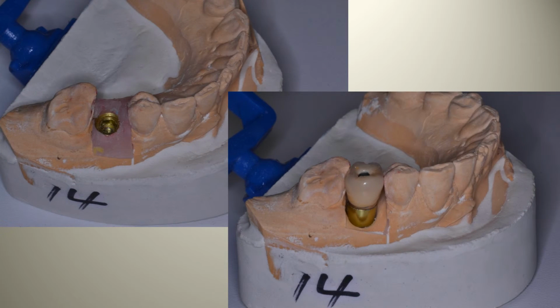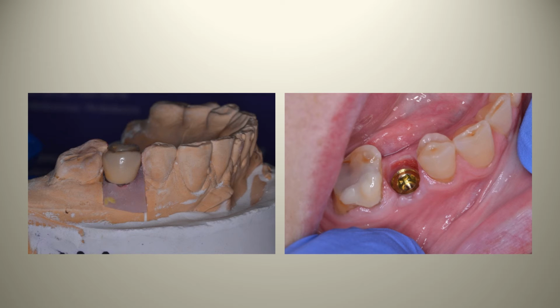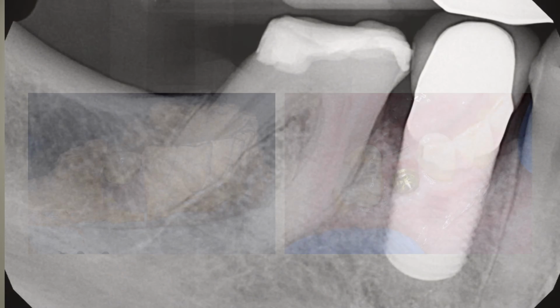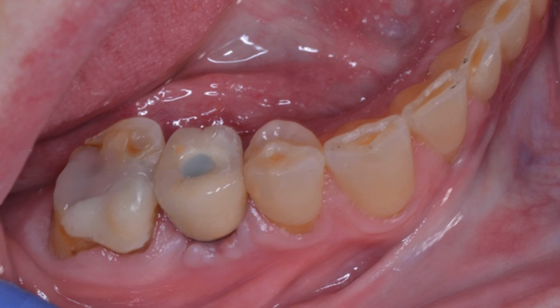And in the next picture, you can see, in this case, we're just sending a UCLA abutment. So this is just one of those cast abutments that are going to be used for this particular 5.7 millimeter implant. And in this picture here, you can see a photograph of the actual model that the lab has poured up and created. So we have two pictures, one with the gum and one without the gum. When we take a look at the next photograph, what we see is a photograph of the crown seated. So you want to evaluate your crowns that come back from the lab without the gum, and then you also want to evaluate them with the gums to evaluate what the emergence profile of this tooth is going to look like.